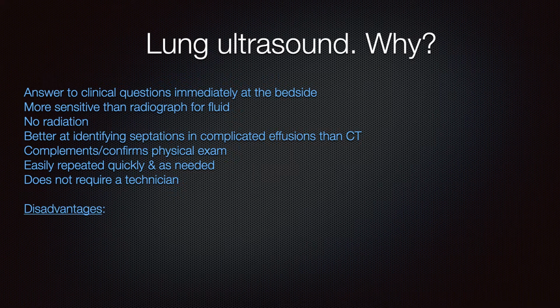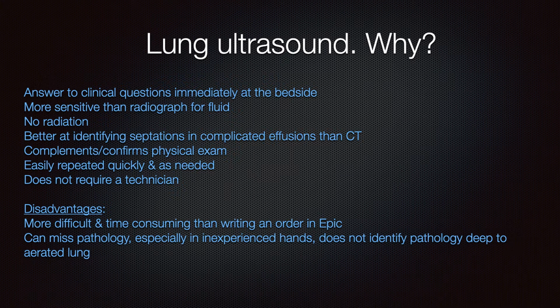The disadvantage is it does take extra time. You're going to have to spend time with the patient. It's much easier to click a box in Epic at times and order a chest x-ray or a CT. And you can miss pathology, especially in inexperienced hands. You want to really be careful with this. Air does disperse the ultrasound waves, so you can miss things that are deep to aerated lung.